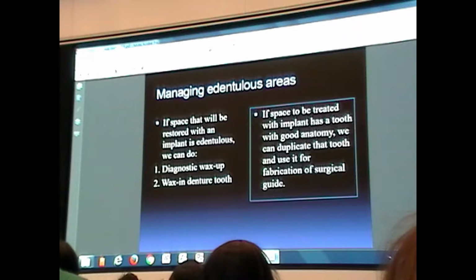Okay, something basic to start with. And that'll be more apparent once you begin to make a provisional restoration for your patient. But it is important for you to think about what is going to be your goal, what can you achieve, and accomplish for this restoration. Okay?